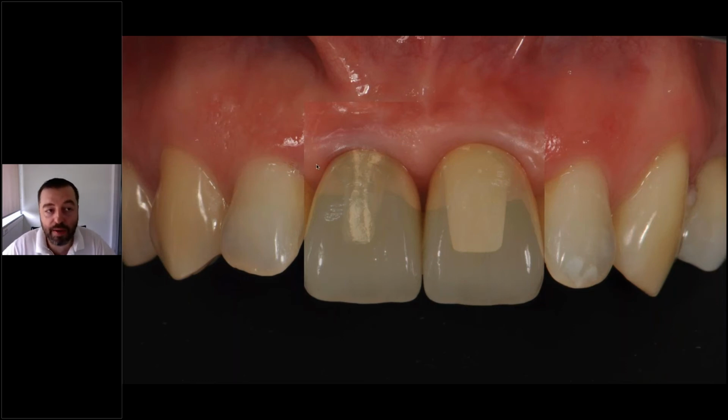The outcome, the benefit with the tissue level implants is that the outcome of the gingiva remains the same, because the shape of the implant is the one that generates the final outcome. So there is no need for any abutment changes or soft tissue management at all.